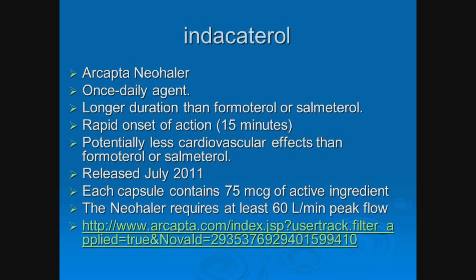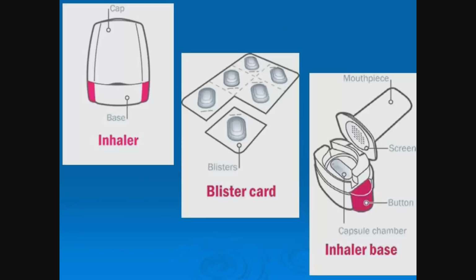Longer duration either than formoterol or salmeterol. Does have a rapid onset of action, so you see some of the effects pretty quickly, and it has fewer cardiovascular side effects. I'm trying to find a downside to this in the process. It does require a fast inhalation with this device, this Neohaler, to get that 75 micrograms of medication in.